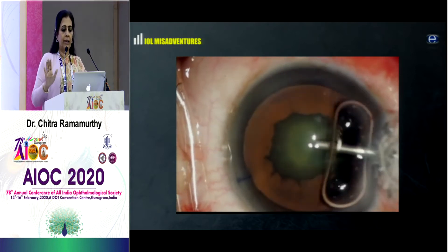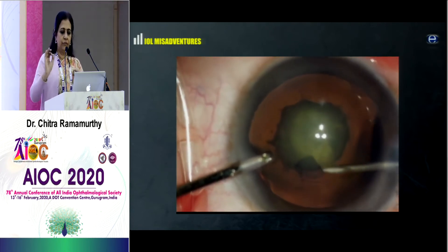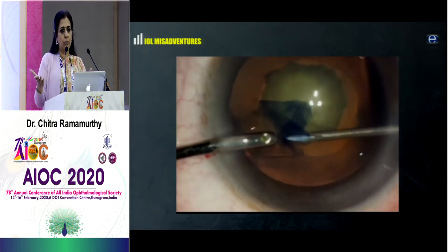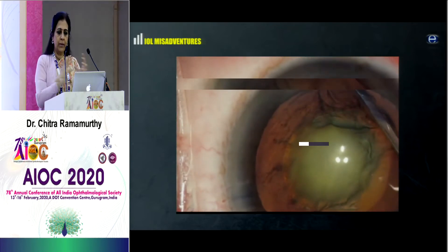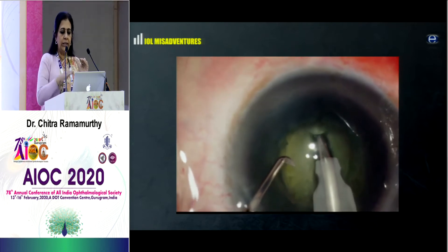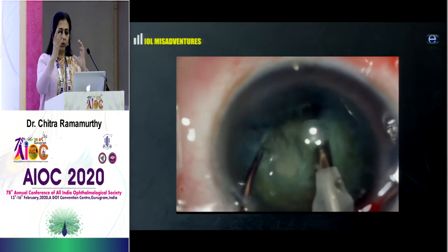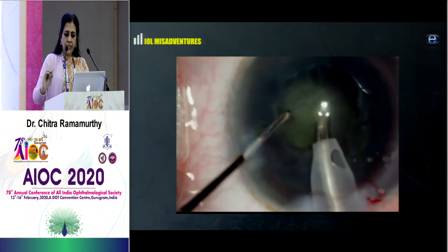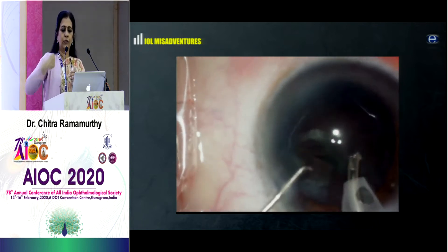This was a polar cataract with riders. With any polar cataract you should operate thinking that you are working on an open capsule. First, you create a nice round rhexis because you believe that rhexis support is where the IOL is going to probably sit. You do not want your bag to collapse; you do not want the hydrostatic pressure to keep fluctuating because the posterior capsule is weak — it could give away, it could dehisce. So very gently I create my first trench, keep injecting viscoelastic so the bag stays distended, and do very gentle phacoemulsification keeping within the pupillary plane.